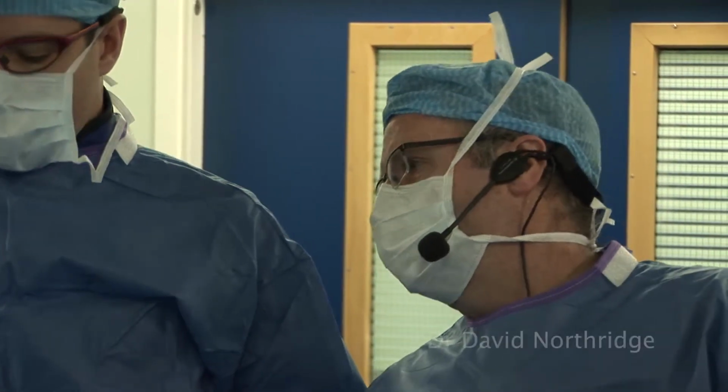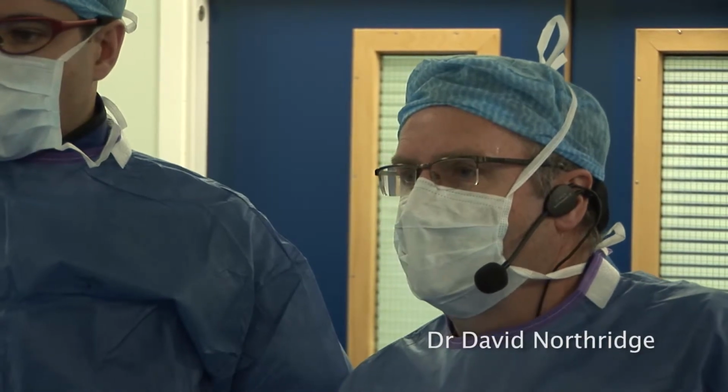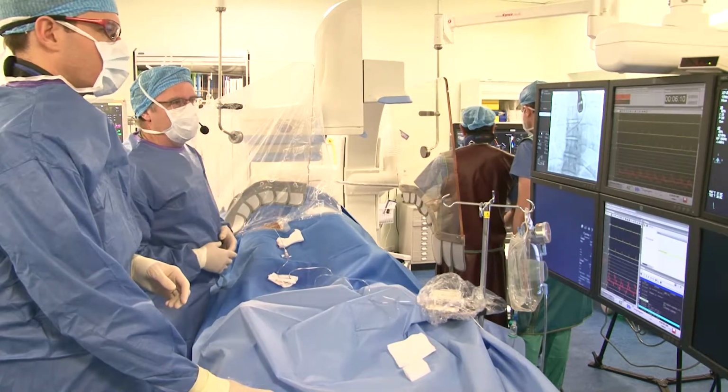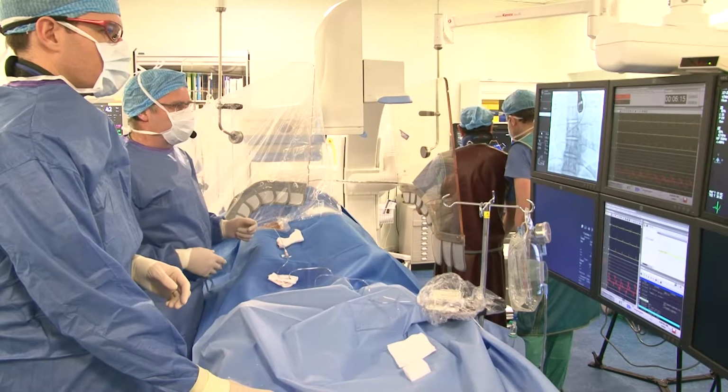Nicola, would you like to record PA pressure, phasic and mean there? And we can see the PA pressure is completely normal. So if someone had a dilated right heart or something, then fine. You just wanted to make sure. It's very easy to do saturations, but we're not going to do that.